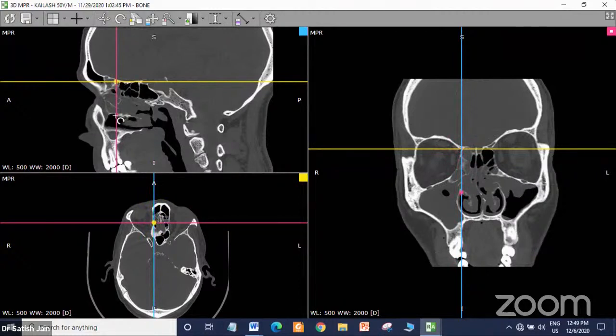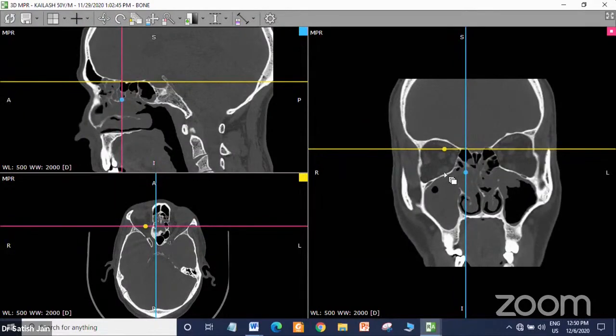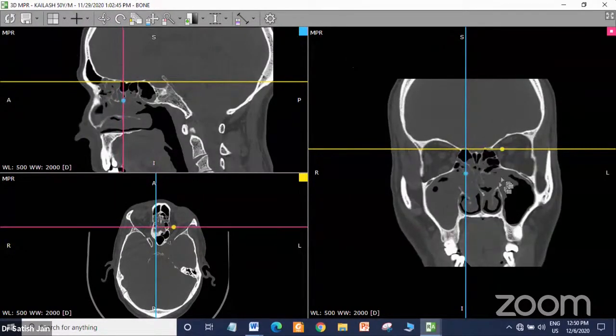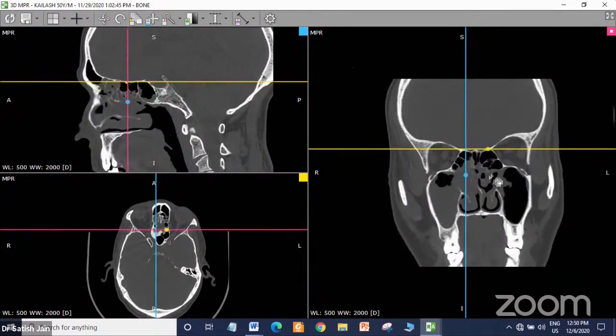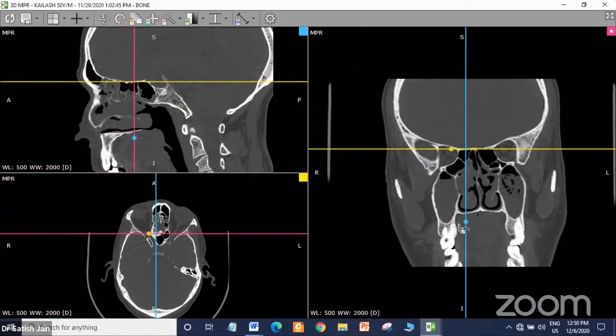So you can say the anterior ethmoidal artery runs through the posterior-most part of the anterior ethmoidal roof, and that is the landmark for the beginning of the posterior ethmoidal roof. That is how you can take this artery as a very good landmark on CT scan. So these are fine points, that reading a CT scan requires time. I am just going through quickly to run through some important points, and you can see the opacification everywhere.